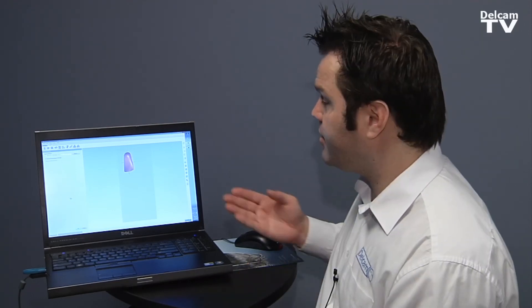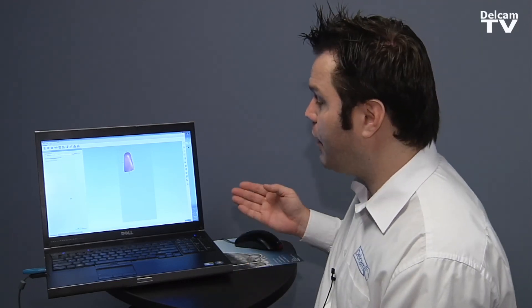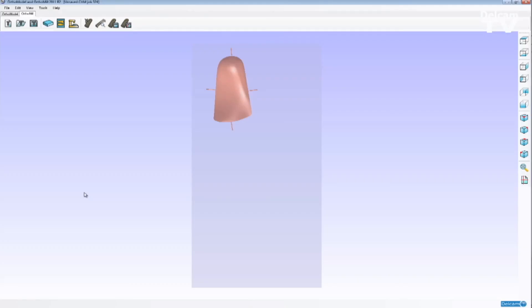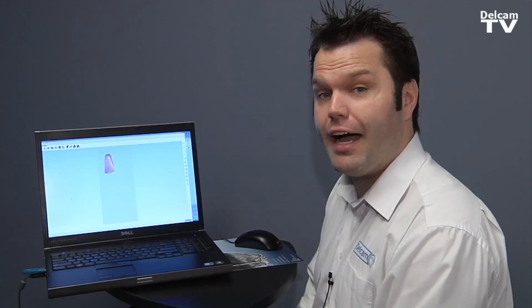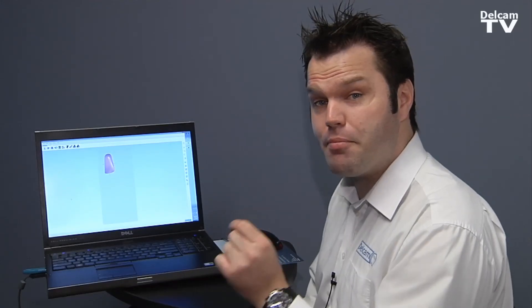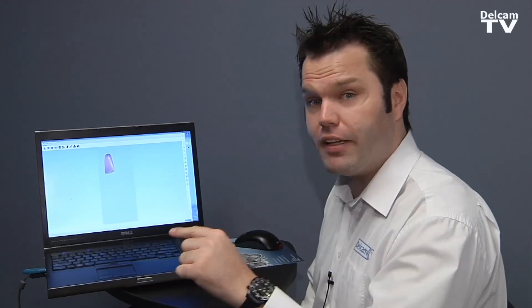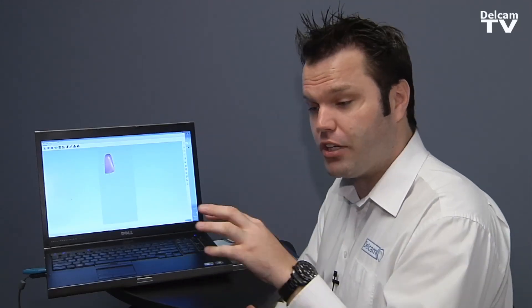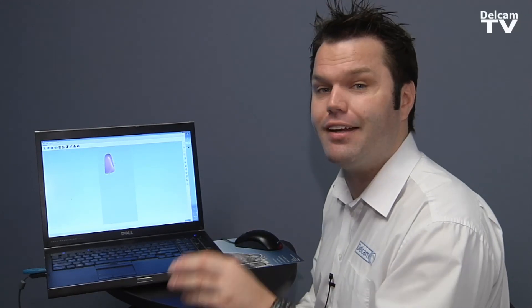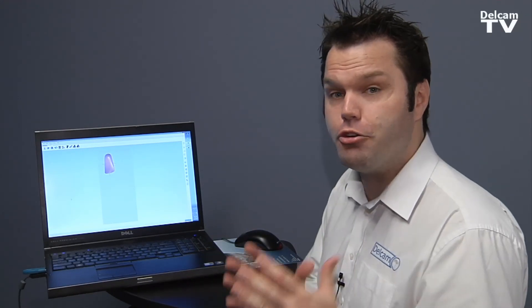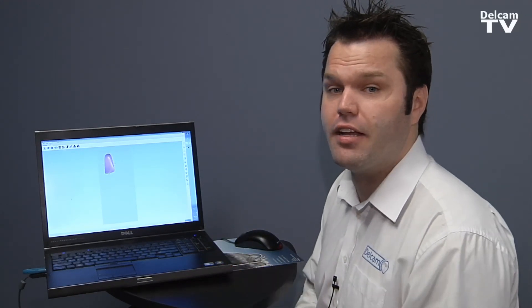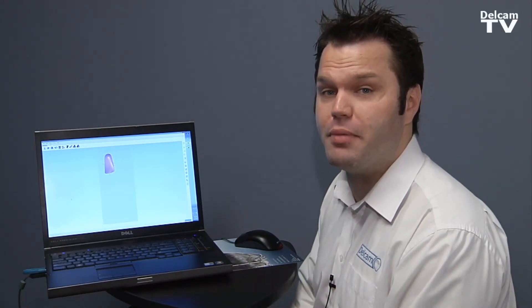As you can see on this block, I'm just machining one orthotic. So I'm going to end up with a hole in this block. If I wanted to use this block tomorrow or down the road, I can select the same block with the hole in there and OrthoMule is going to tell me exactly where it is to maximize the used material.